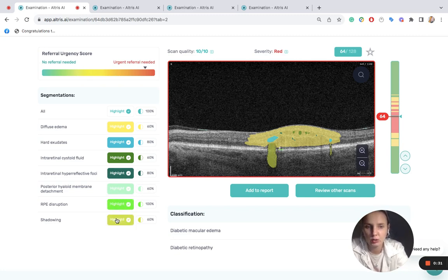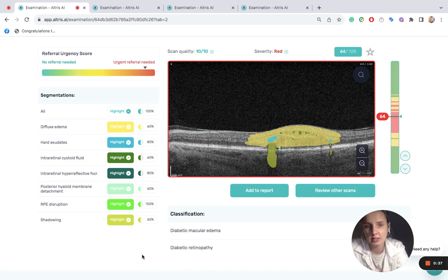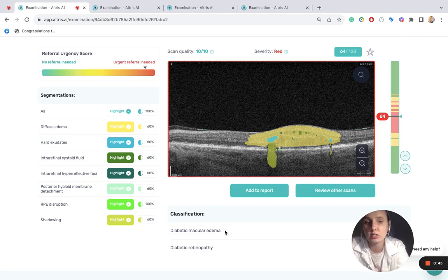It is amazing how clearly we can see hard exudates, diffuse edema, and cystoid cavities here. AI segmentation and classification also shows that there is a diabetic macular edema on the OCT scan, which can support diagnostic decision making.